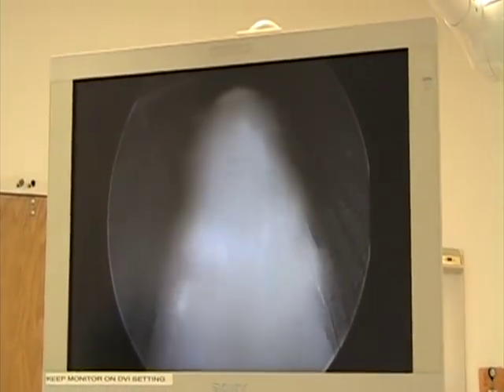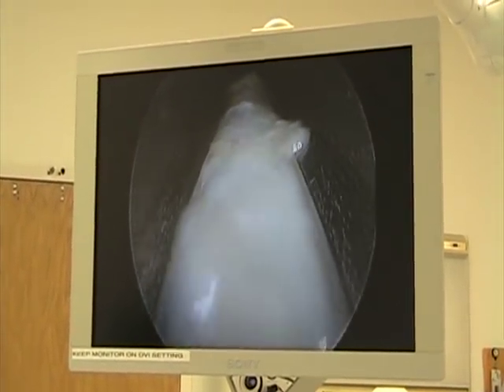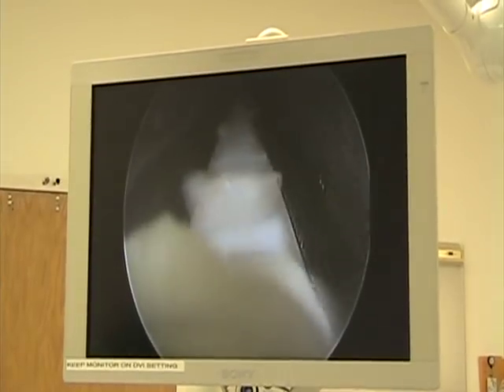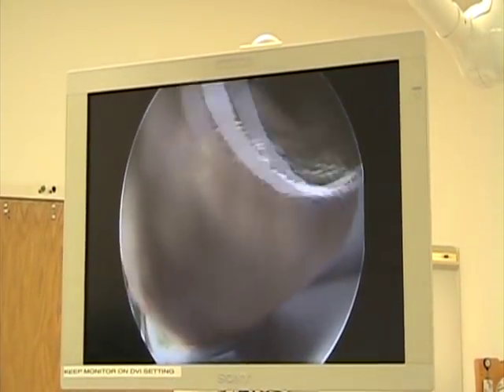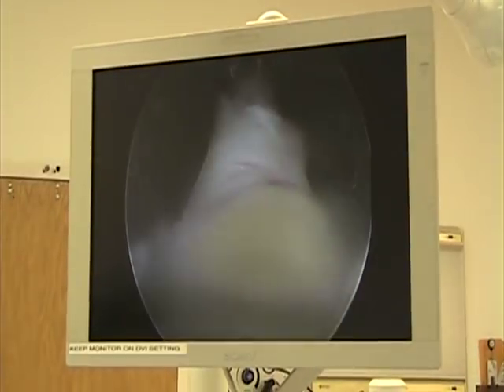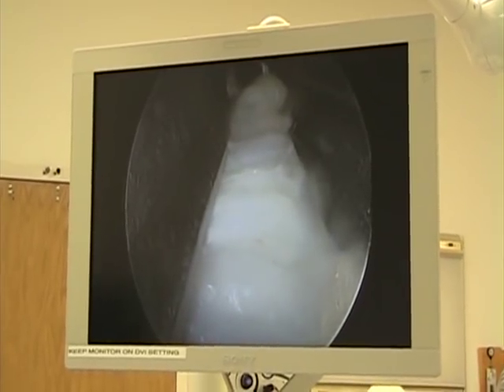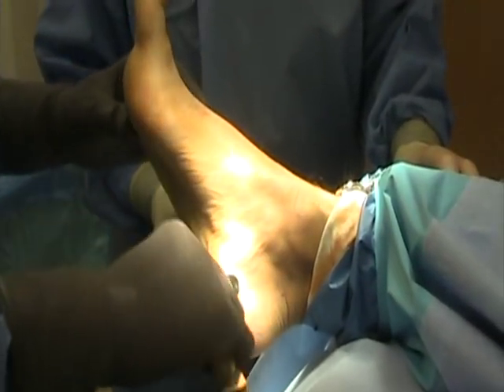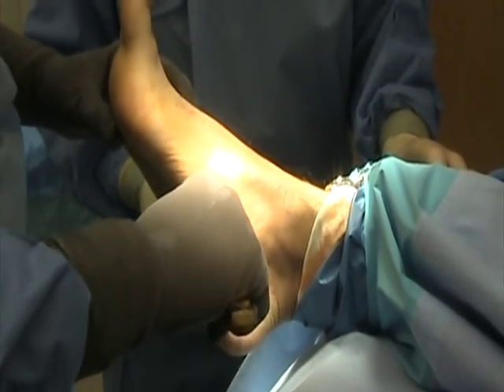What we're going to try to define is the medial band of the plantar fascia, which I'll typically define by just measuring on the plantar aspect of the foot. Then we're going to take a little triangle blade and measure about a third to a half over the plantar surface of the foot.